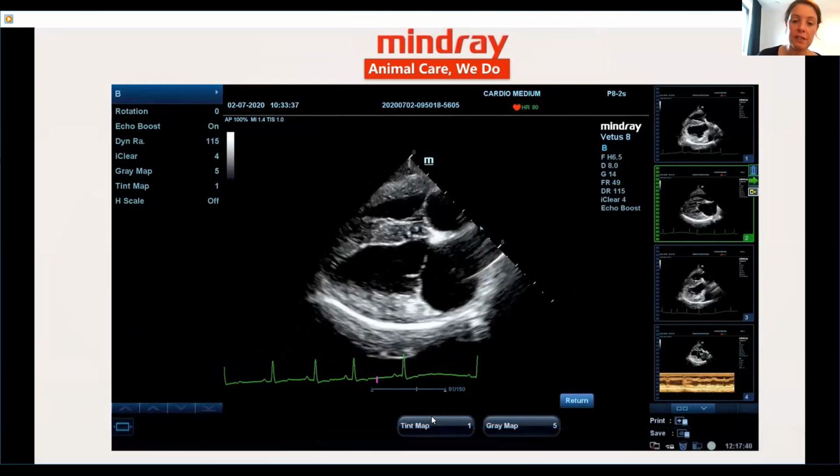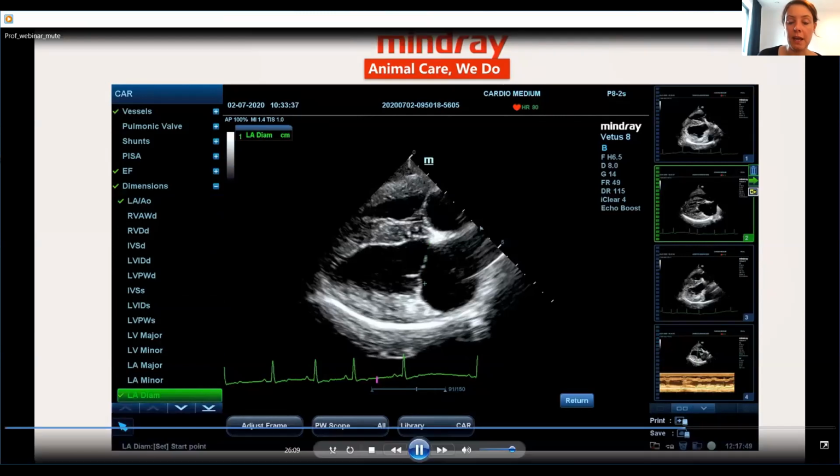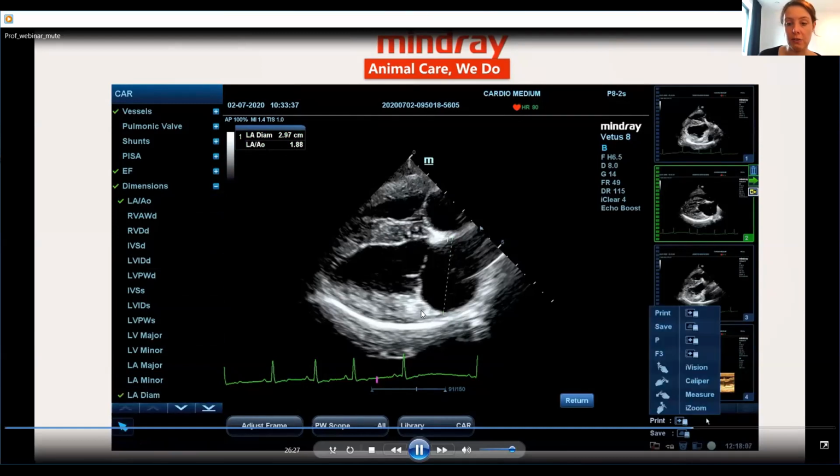Okay, yeah, this is actually what I was talking about. So you can measure the left atrial size compared to the aorta in the short axis view, but what you can also do is measure a long axis atrial diameter. And for that, we go back to our right parasternal four-chamber view, and you see here the mitral valve annulus, and you try to draw a line through this. And then you try to stay perpendicular to this imaginary line through the mitral valve annulus. And then you orient yourself and you measure from the interatrial septum, which is here, to the free wall of the atrium, which is here. And then you have the left atrial diameter in systole.